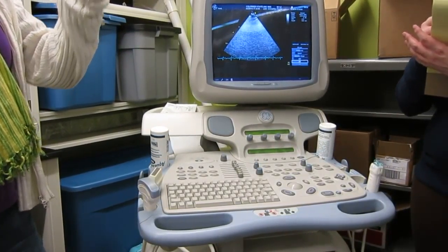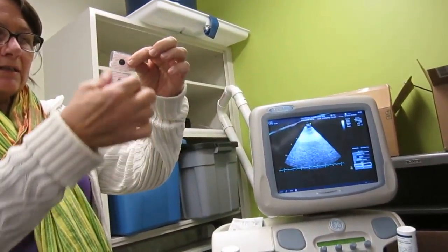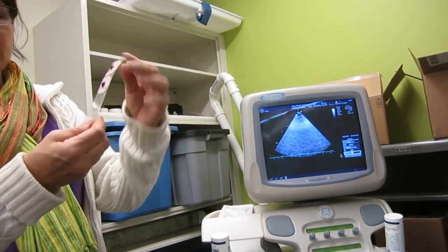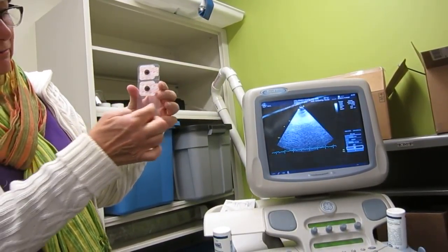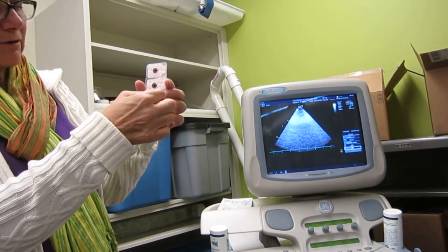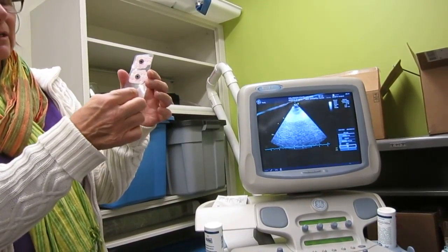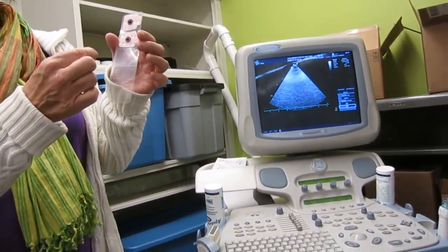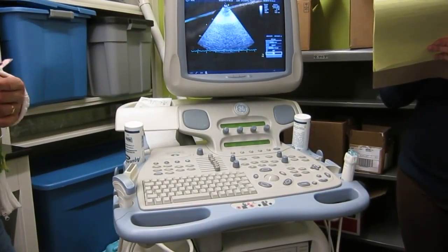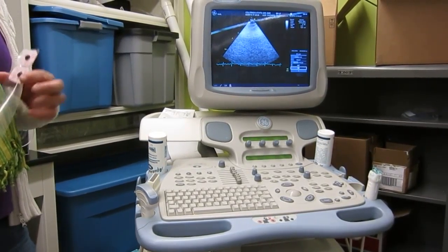It narrows the sound beam, so if this was our beam coming down, it would put a waist in it, like an hourglass waist, and it narrows it so your lateral resolution is really good, okay? Because if you had two different structures right in here with this beam width, it would look like one thing. But if you narrow it so that it's narrower than the two of them together, then it'll look like two different structures. Okay, so that's what your focus will do for you. So leave it where it's defaulted, and then when you really want to focus on a particular area of your study, you can move your focus.